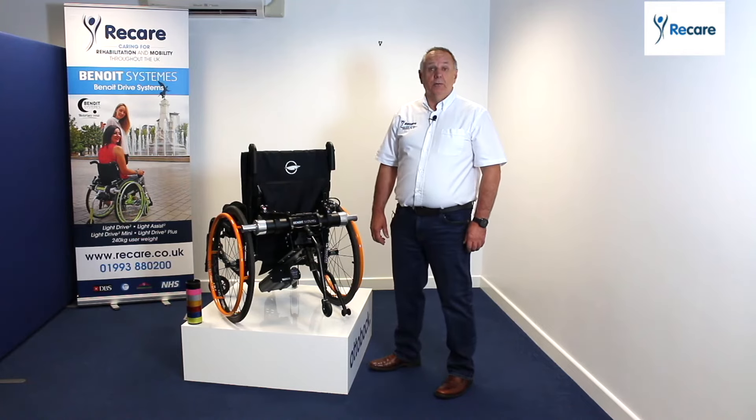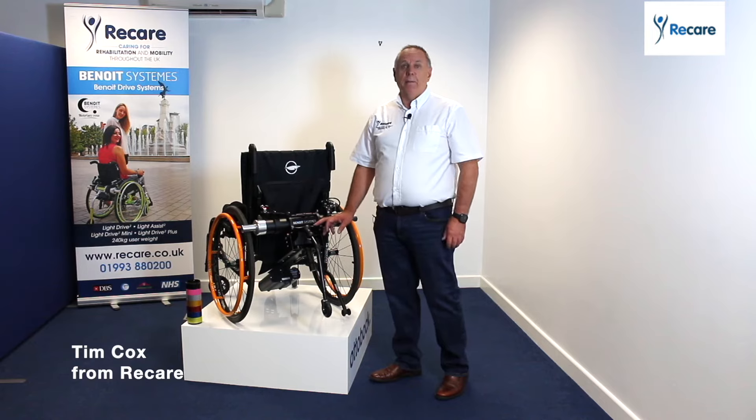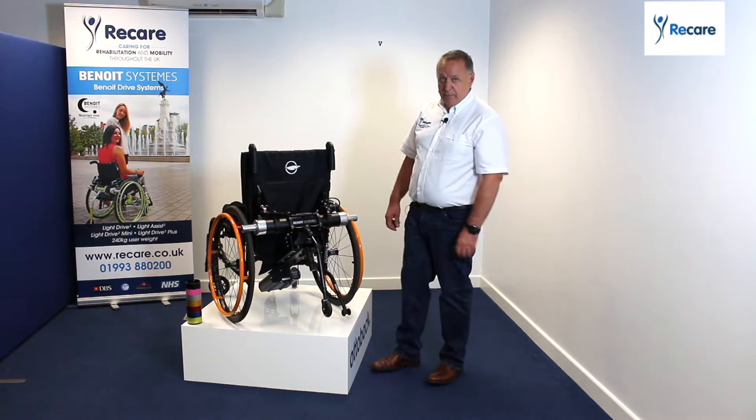Hello, my name is Tim Cox. I work for a company called Recare. I'm going to talk to you today about the Benoit Systemes direct drive power add-on, which fits on most manual wheelchairs.